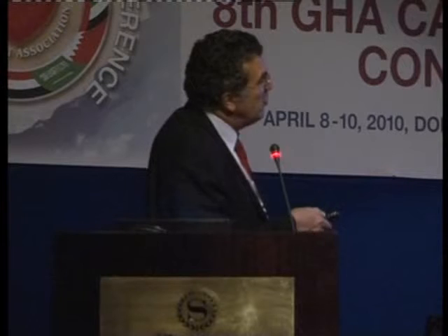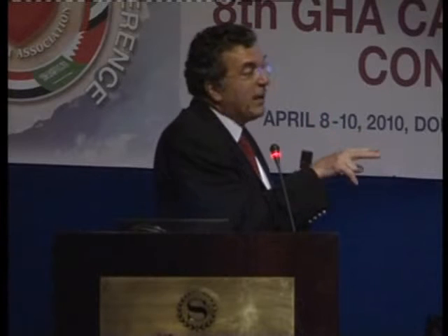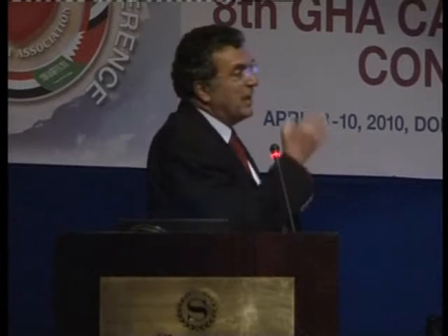Well, the stent is starting at that point, just below the bifurcation, so we can place high pressure and there will be no impact. The other point is to be sure that there is nothing at the ostium. I think the best is to remove the wire, because every time the wire changes the angle of the bifurcation, and you can have some spasm or accordion effect.